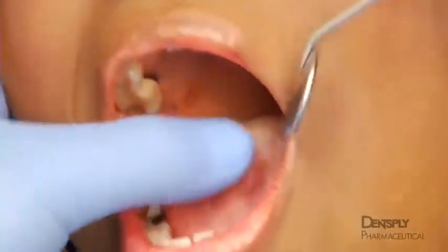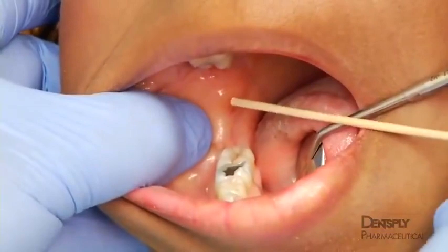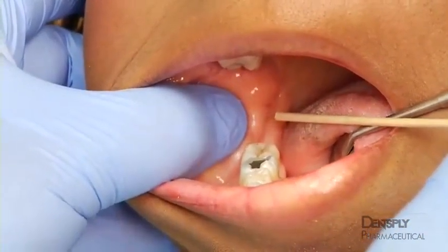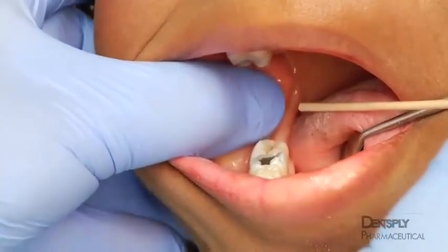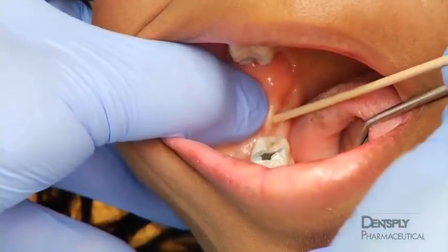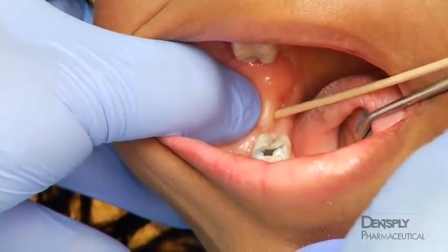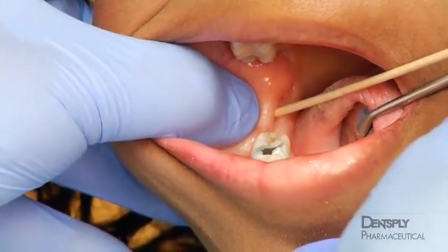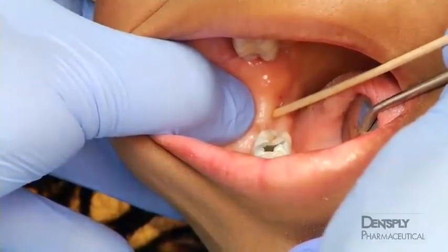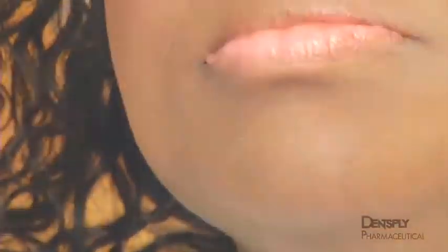Perhaps the most common cause for failure of the standard inferior alveolar nerve block is positioning the needle tip too far inferiorly. This can happen if the coronoid notch is not palpated correctly, for instance, if the thumb is too medial and palpates the temporal crest. Even if the notch is correctly identified, bisecting the thumbnail will misidentify the insertion point if the thumb is not parallel to the mandibular occlusal plane.